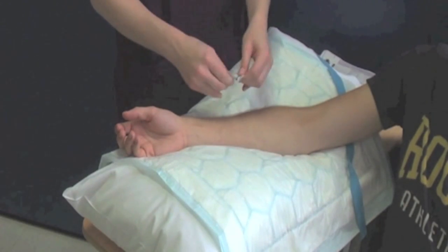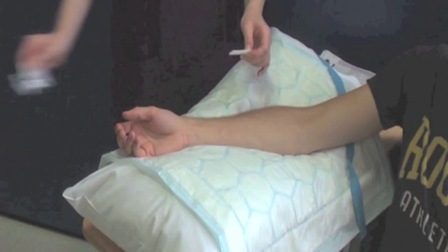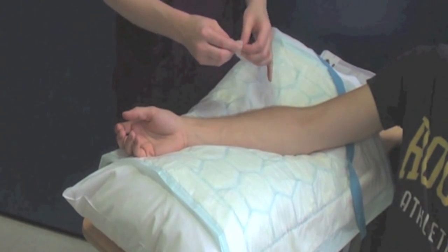Use the Chlorhexidine wipe to clean the patient's skin using a vigorous rubbing action and allow the skin to air-dry for 30 seconds.